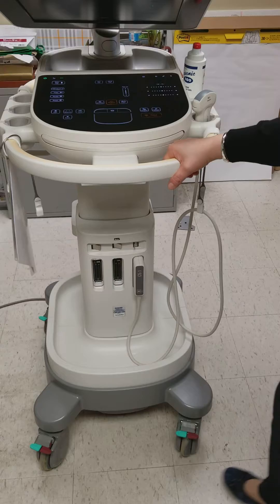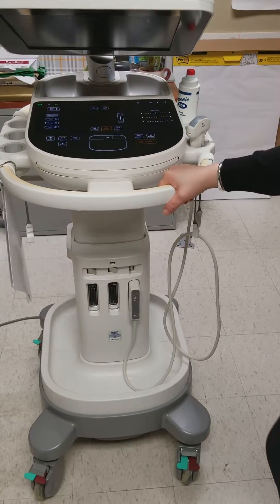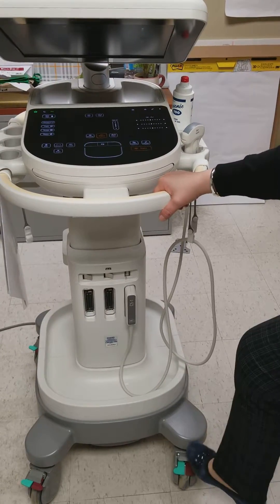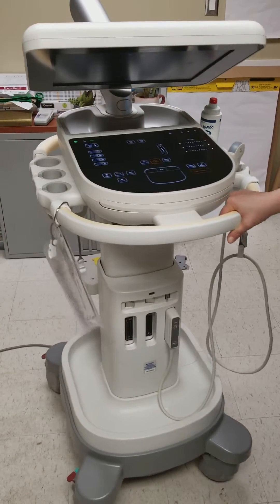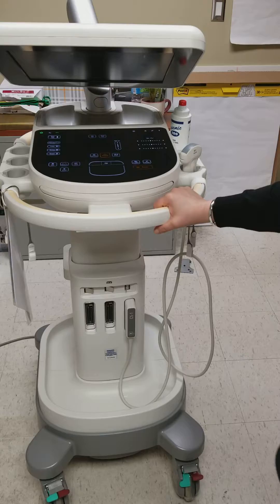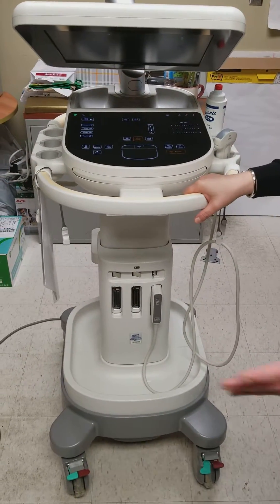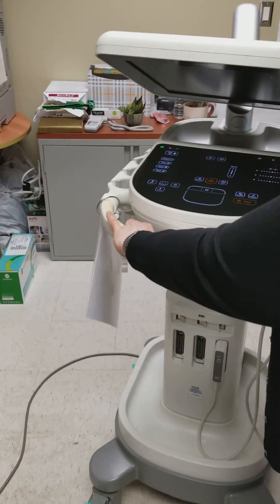There are lock brakes on here. To lock it, the rep recommends pushing down both the green and the red one. To unlock it, just push the gray one. To move it, it's on a swivel right now — the recommendation is to use the green one, which acts like a steer mode, similar to the fifth wheel on a stretcher. It moves and steers quite easily.